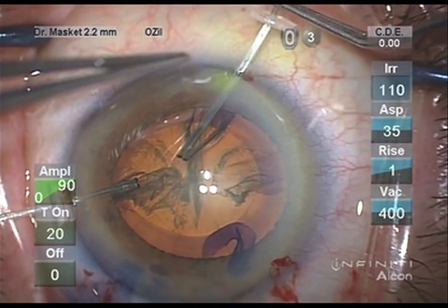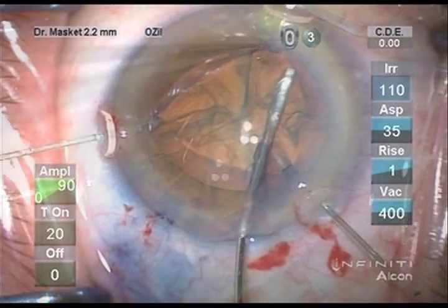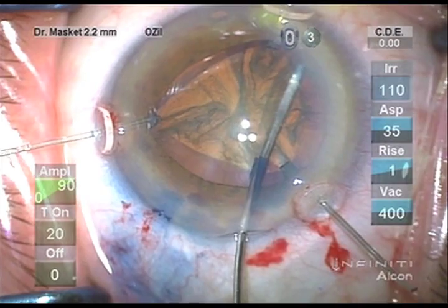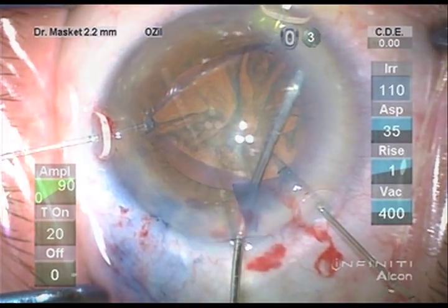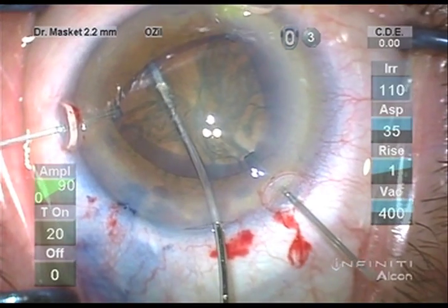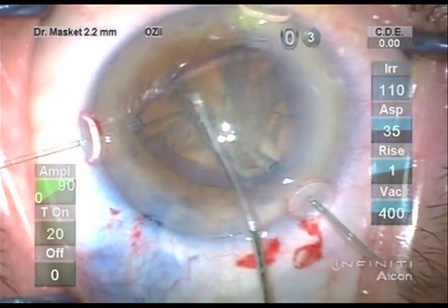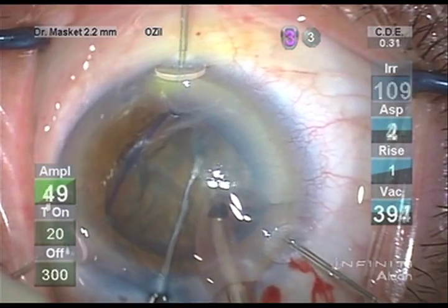The MST system comes with three hooks per package, and I place the three hooks 120 degrees apart, creating somewhat of a triangular appearance to the anterior capsule. Copious hydrodissection is performed in order to free the adhesions between the cortex and the capsule so as not to additionally weaken zonules during the surgery.